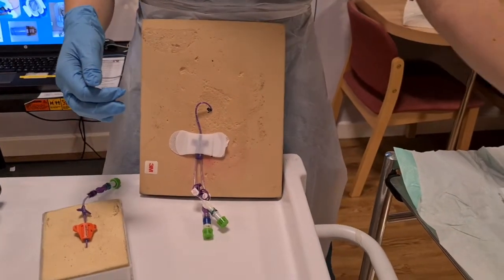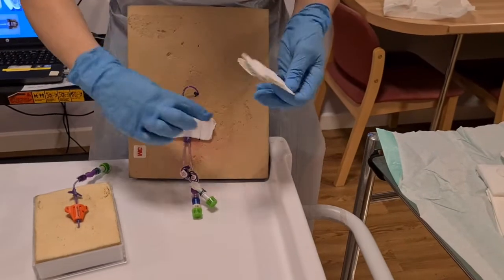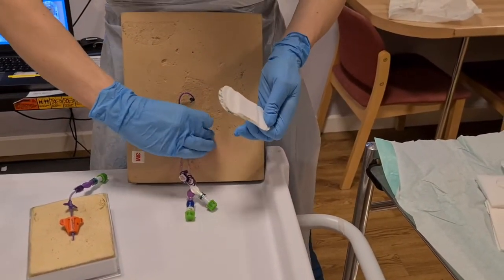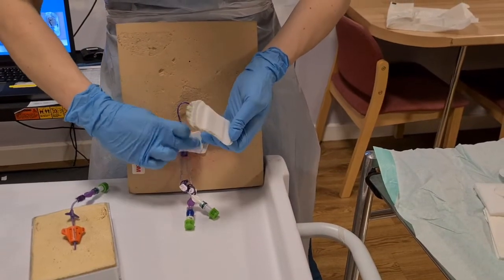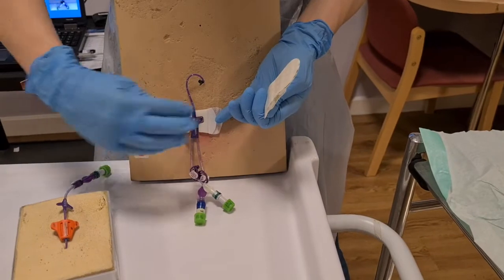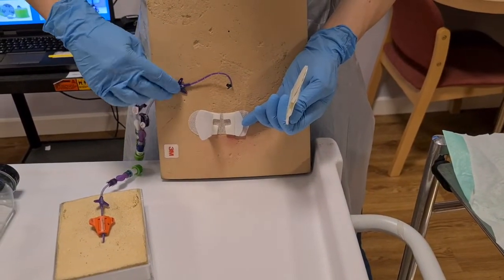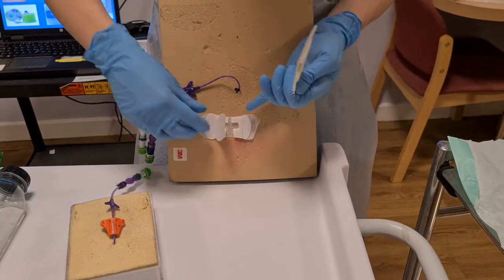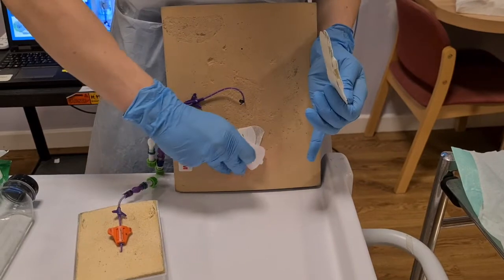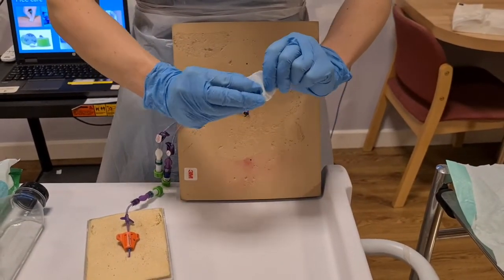Then I'm going to go to my grip lock. I'm going to remove the existing grip lock, so it goes one side. You've got a little bit of Velcro there, pulling that off like so. Removing my grip lock, possibly getting another member of staff to hold it in place if you're worried about the line migrating. Taking the grip lock off. Remember the little tabby bit, pulling that to the side.